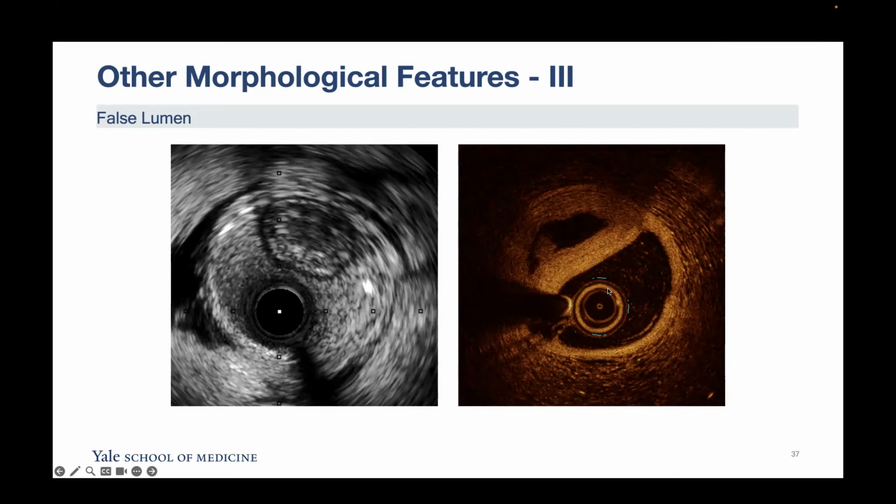To me, the problem is more propagating dissections. In this case, it's more a matter of forcing the catheter distally, which can happen with OCT and IVUS. So it's the wires and catheters going down, as opposed to only the contrast going down, because you're giving angios one after the other, and you don't have those progressions.